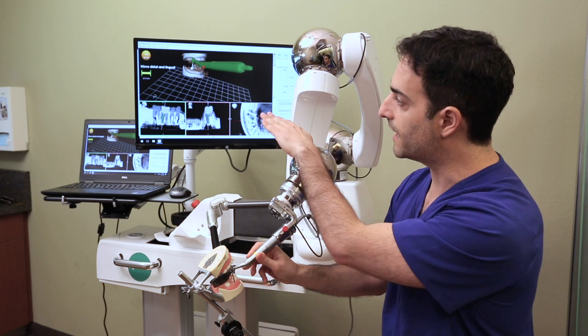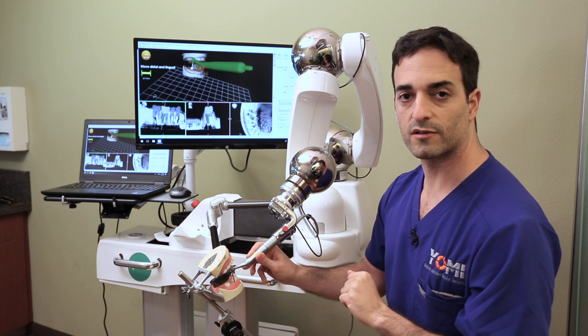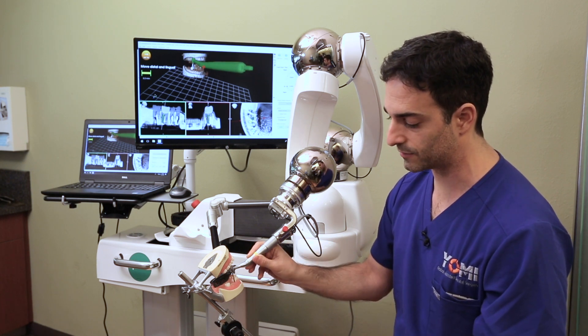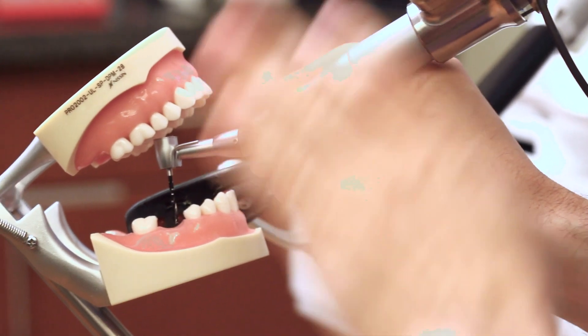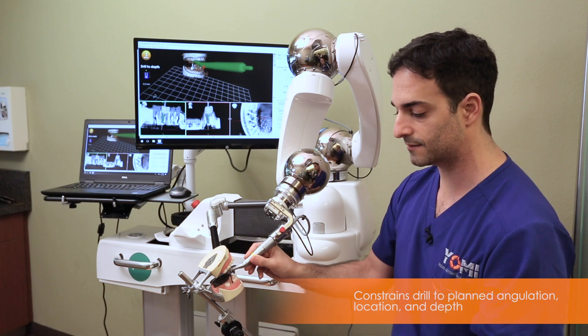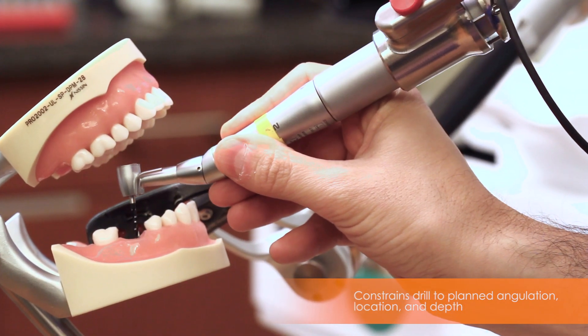Now I have the right angle, but I need to translate to get to the starting position. On screen it says I need to move up five millimeters distal and lingual. Again, physically it's going to be very easy — I just slide distal and lingual, and it stops me when I have the right position.